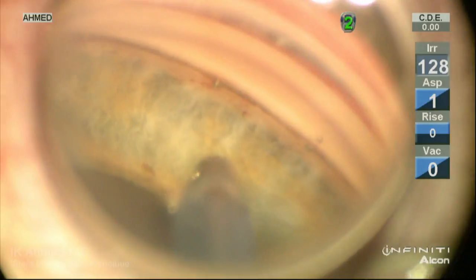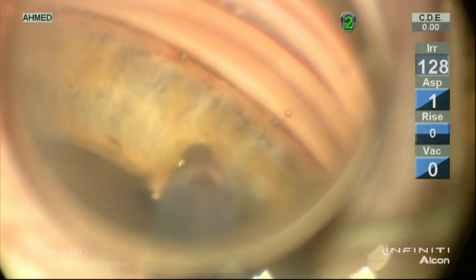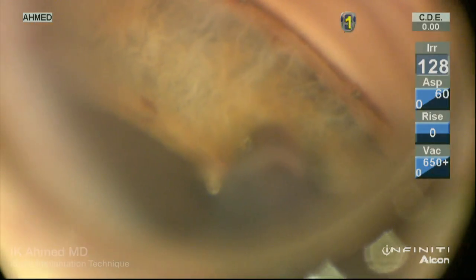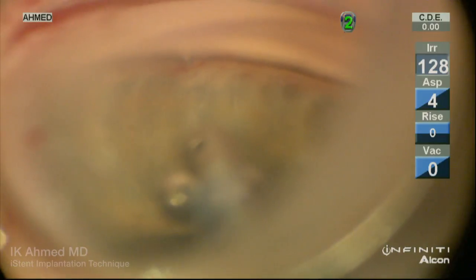We can visualize the three implants being placed approximately 2 clock hours away from each other. A closer view shows the nice flush appearance of the snorkel end emanating from the inner wall.